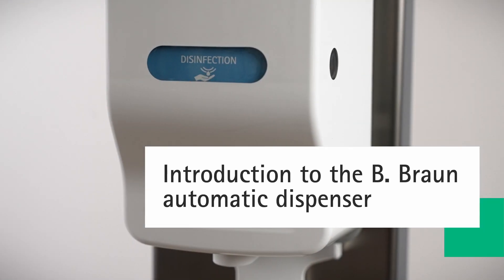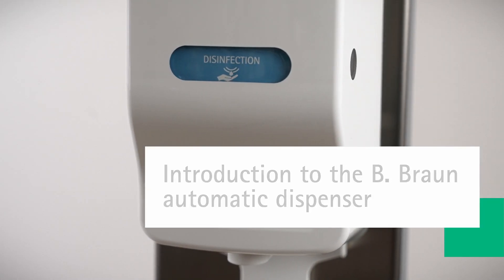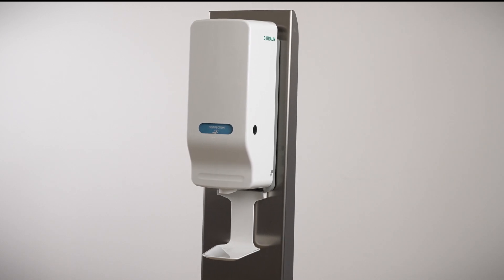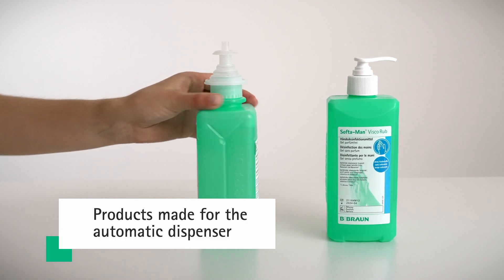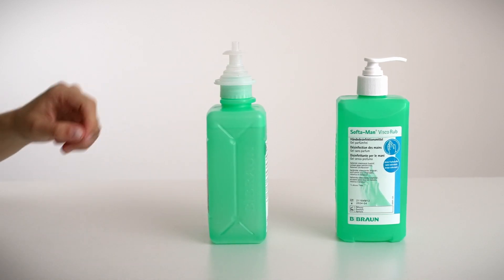Welcome to the short introduction to the Automatic Brown Wall Dispenser. It is important to know that the Automatic Dispenser is only made for collapsible bottles. This means no other bottle will fit into the wall dispenser.